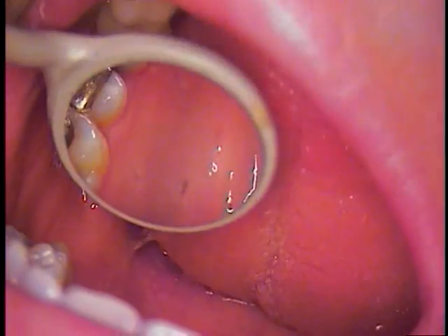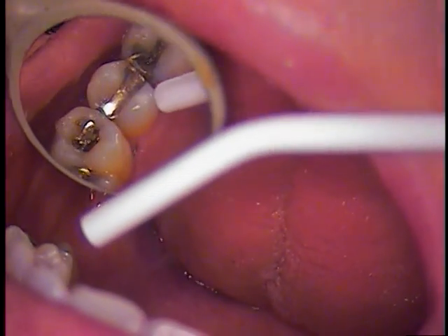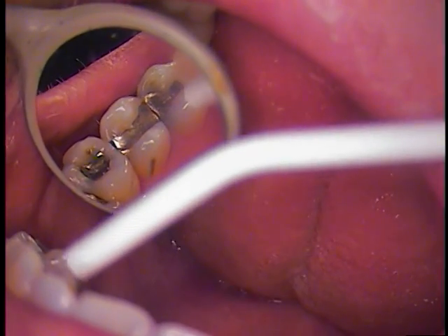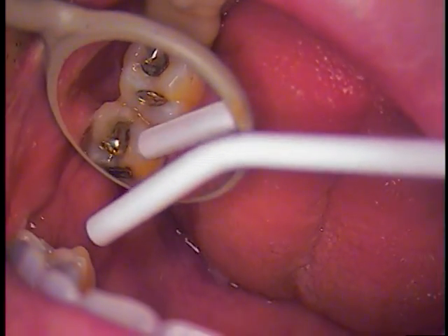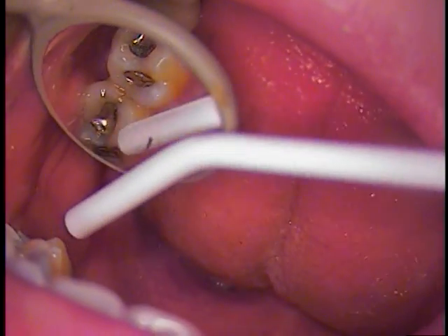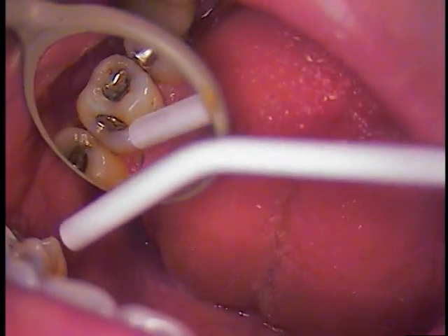There we go, and that's it. Those are nice restorations — really happy with things. And we have the upper left quadrant to do next. We'll just take a quick peek at that. So we've got some more amalgams. What I would do is maybe do the first molar and then the second molar — maybe alternate.